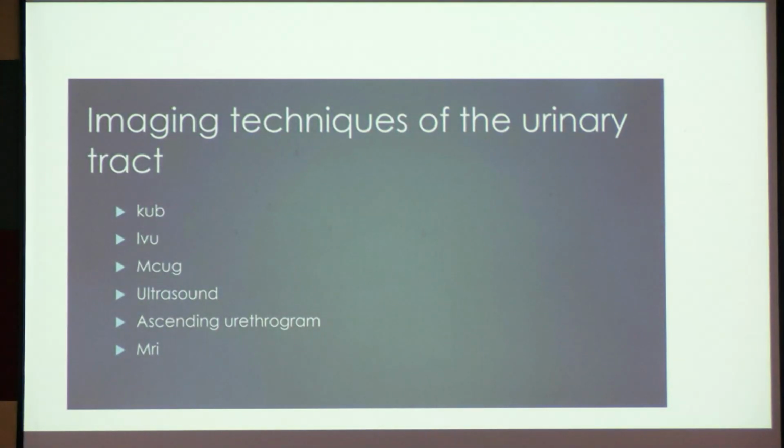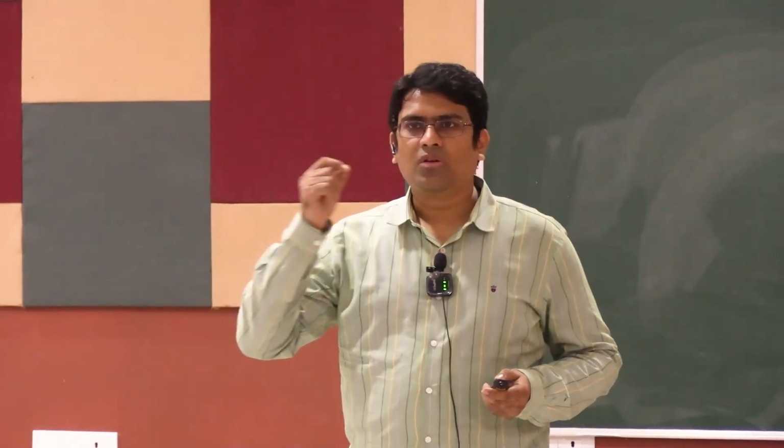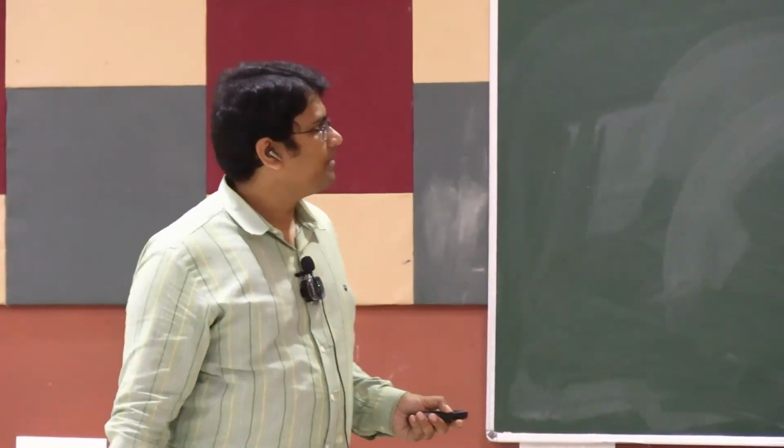Okay. So there are various imaging techniques which ultimately help us to track the whole urinary system. The most common of all is a USG. Apart from that, there is X-ray. X-ray with a contrast is known as IVP. There are the three-dimensional imaging modalities, which are the CT scan and the MRI. A CT scan again can be contrast and non-contrast, and nowadays the more advanced versions are contrast with urography. So what is a urography? It is nothing but 3 phases in which the CT scan will be taken so that we can have a better visualization of the entire length of the urinary tract.